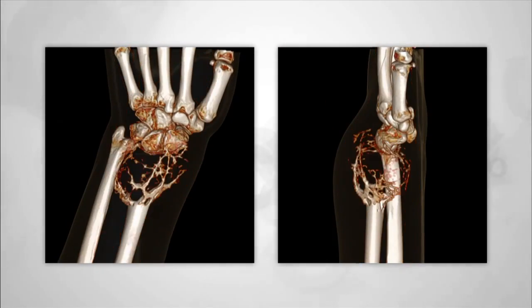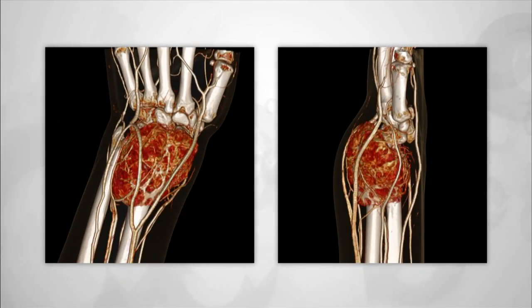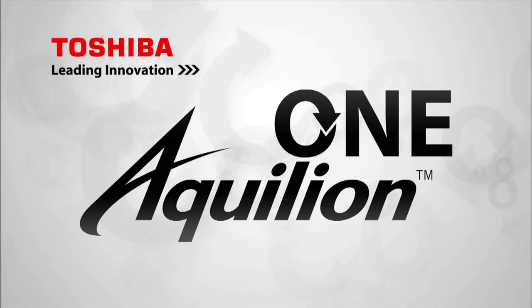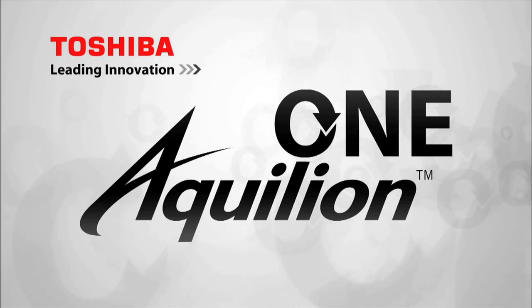data simultaneously. Lastly, this wrist CTA, as we watch the flow of contrast into and out of this osteosarcoma of the wrist. Once again, anatomical and functional data simultaneously on Aquilion 1. This is the essence of dynamic volume CT. Motion, flow, anatomy, and function, all in one acquisition, and only with Aquilion 1.